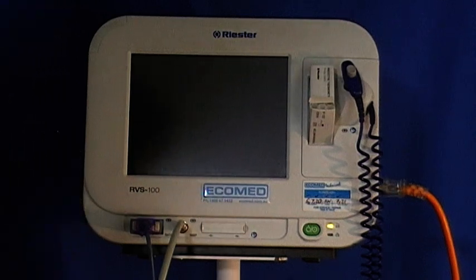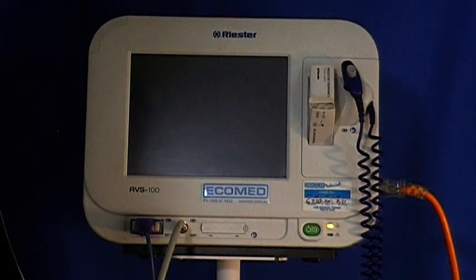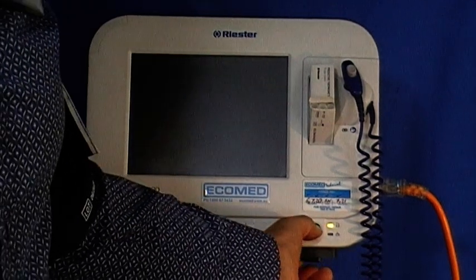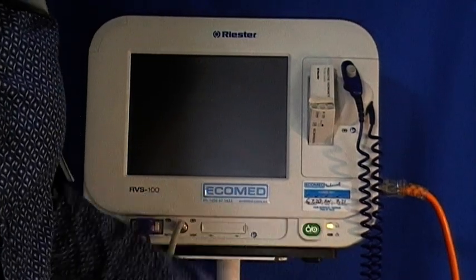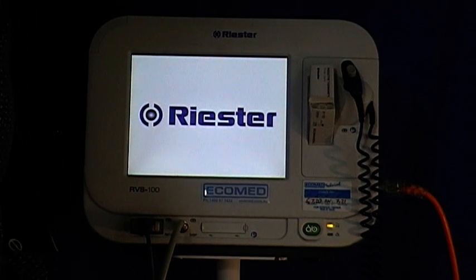Today we're looking at the Riester RVS 100 and a quick guide to using it for vital sign measurements. Firstly, to switch the unit on, press the green button to start the unit. The lights will come on and it will take a number of seconds to get to the screen we want to use.